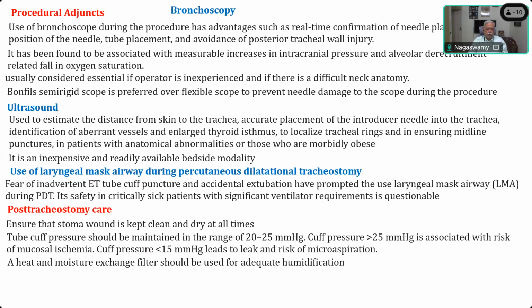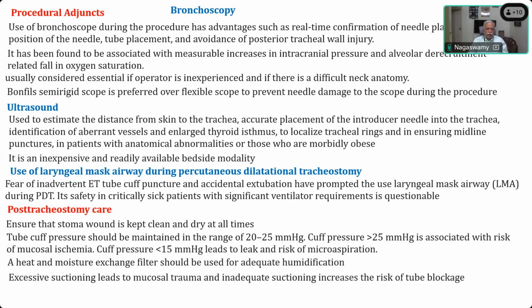A heat and moisture exchanger filter should be used for adequate humidification. Excessive suctioning will cause mucosal trauma. Inadequate suctioning will increase the risk of tube blockage. So tracheal suction should be done gently and timely.